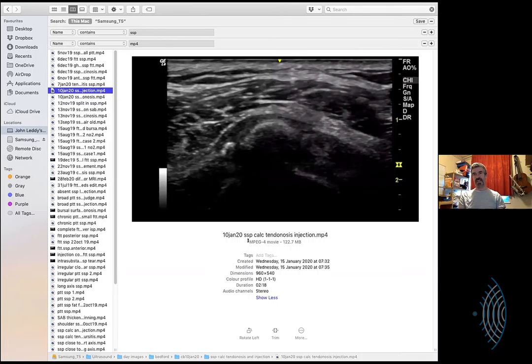And then I'm just popping the needle into the calcium itself, or just irritate the lining. So I'm deliberately then just poking the bit of calcification to hopefully provide it a reactionary inflammation, or to hopefully allow it a way out. Like it's okay. Yeah, I don't know that it helps, but that's what we do when we do barbotage.